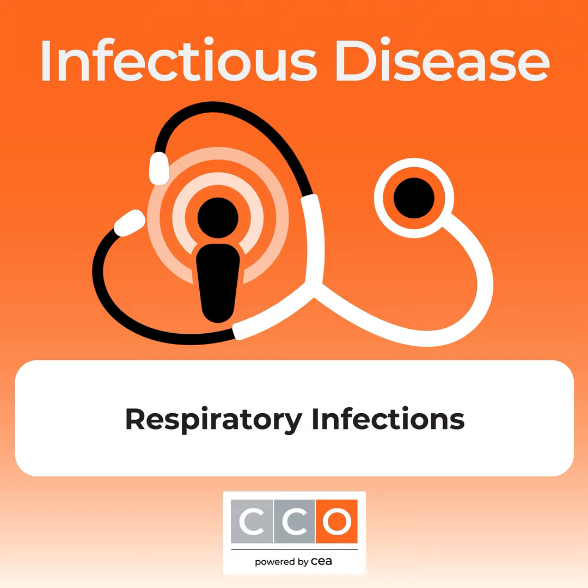So let's talk about the impact of these panels. How do these panels actually change care for patients? And so this is a trial that was done in hospitalized patients. It was a single center study. It was open label. And what it did is it randomized at the laboratory level patients, or workup of respiratory tract specimens, to the FilmArray pneumonia panel plus culture and susceptibility testing. That was the intervention group versus just culture and susceptibility testing alone. That was the control group.